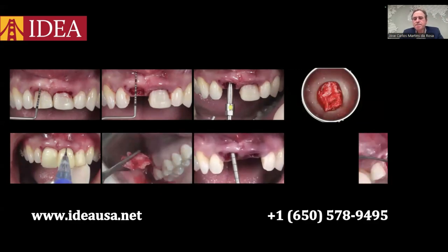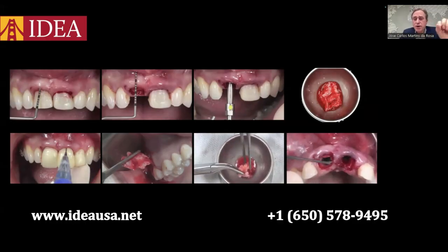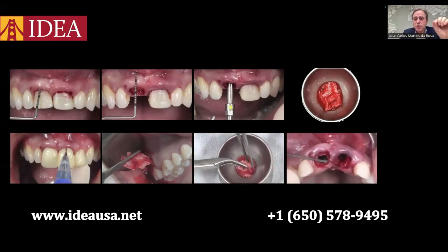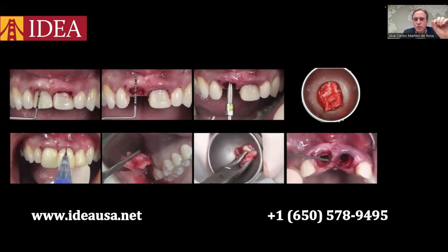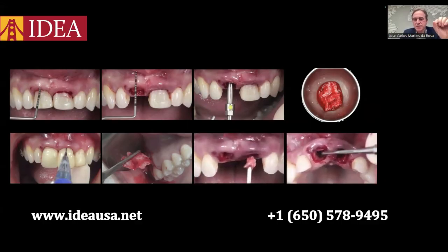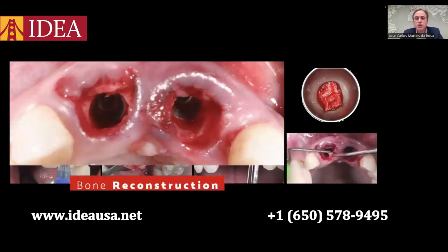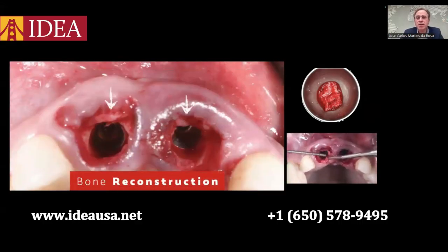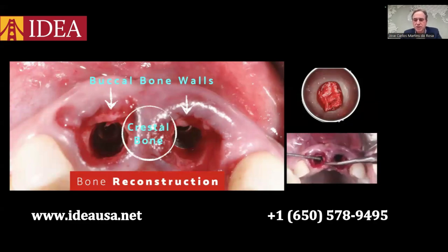And then we rebuilt the crestal bone underneath the papilla using particulate bone graft harvested from the maxillary tuberosity. As soon as we finished the 3D bone reconstruction, we had restored the 2 buccal walls that the patient had lost plus the crestal bone. When we finished the bone reconstruction, we immediately installed the provisional bridge, as you can see here.